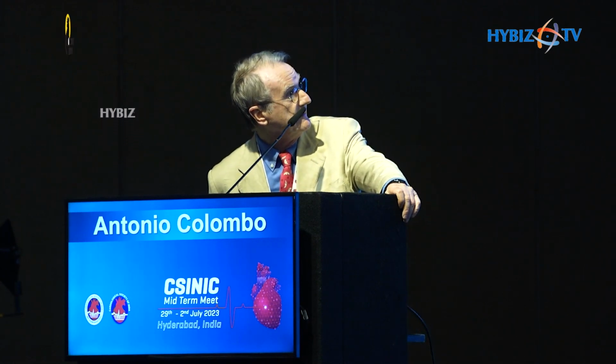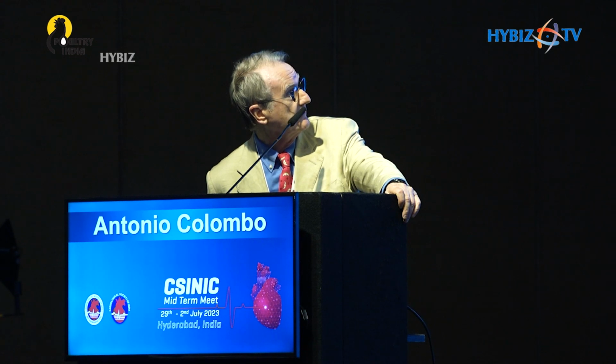We published this left main lesion requiring two-stent strategy, and there was a higher occurrence of TLR for restenosis of the left circumflex coronary ostium. And these procedures were mainly done with IVUS guidance. Despite this high restenosis with the hazard ratio of 2.5, there was no cardiac death at 2 years in patients with restenosis of the circumflex, and the minimal impact on symptoms. So basically, this side branch problem is a visual problem more than a clinical problem.